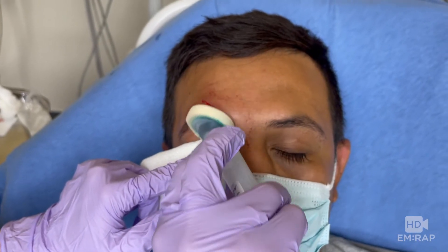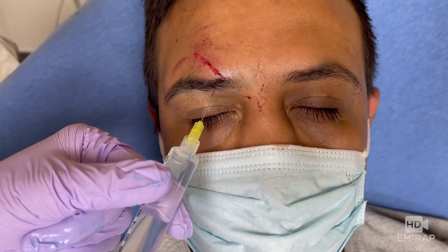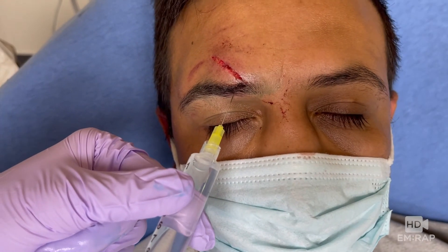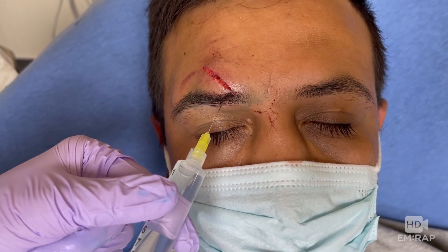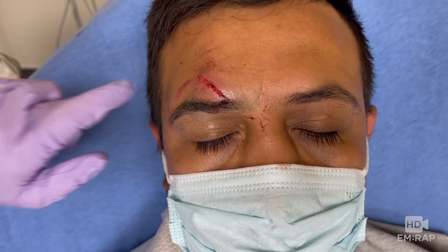Prep the skin with cleansing solution. Then, using a small gauge needle such as a 25 or 27 gauge, inject 1 to 3 milliliters of local anesthetic just medial to the supraorbital notch and just superficial to it. This should adequately anesthetize both the supraorbital nerve and the supratrochlear nerve.